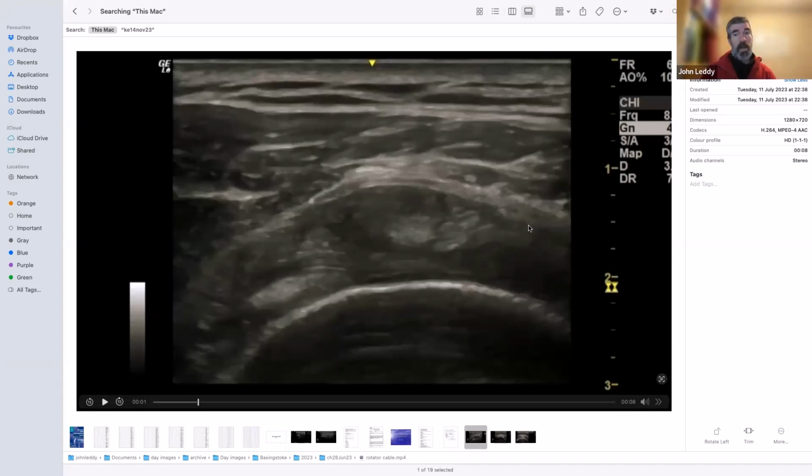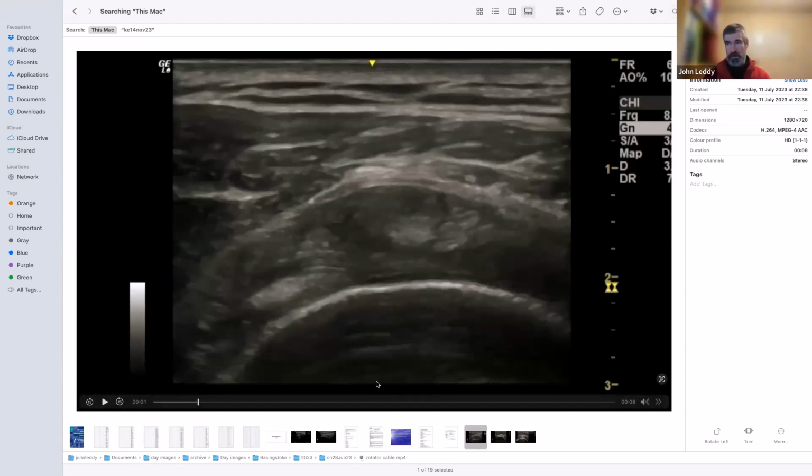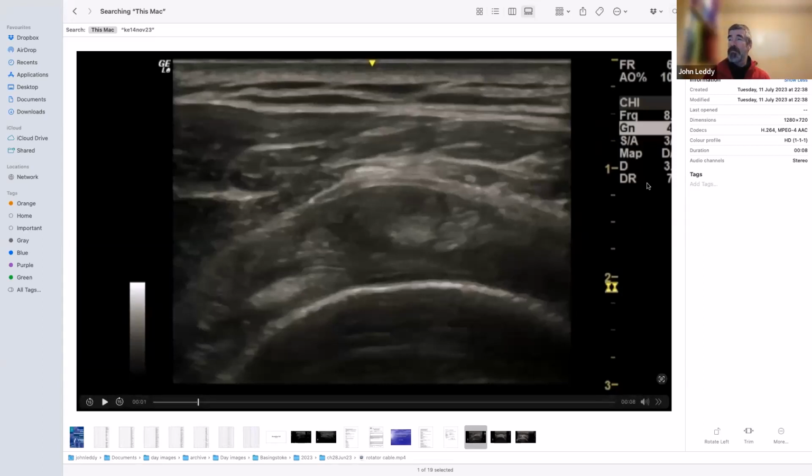I'll pick out a video because it's very obvious in a lot of cases when you angle the probe to see it. Next time I'm scanning a reasonably thin shoulder, I will just do a quick video for you. I've got one somewhere, and I posted one on Twitter where I followed it in. I'll look for it, or I'll just video another one because it's always there. But you have to play with the angles so that you get the anisotropy on one nicely and a very good return on the other, and then you see this pattern. I would like that.